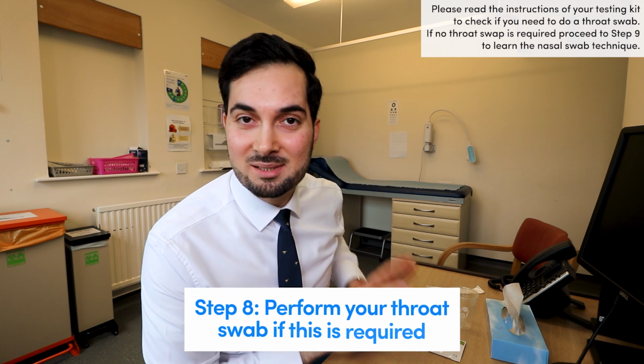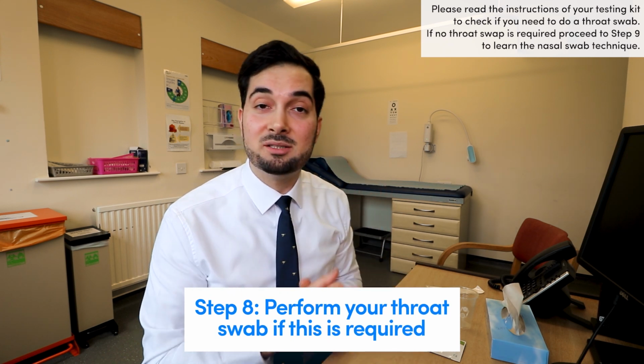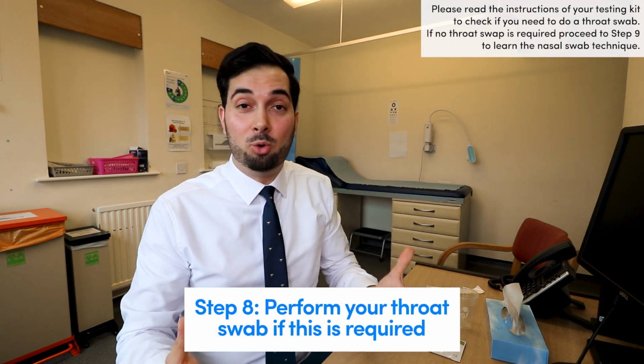Now, if you are someone who just needs to do a nasal swab, like the IVD one, then just move to step number 9. Miss step number 8 that I'm going to go on to next, because this is all about the throat test and the nasal test, okay? Let's keep on going. Moving on to step number 8. Now we're going to look at the throat swab. So if the instructions state on your test kit that you need to do a throat swab, this is exactly what you need to do.